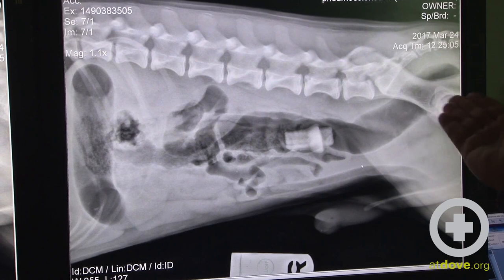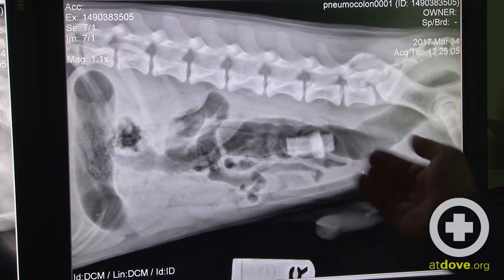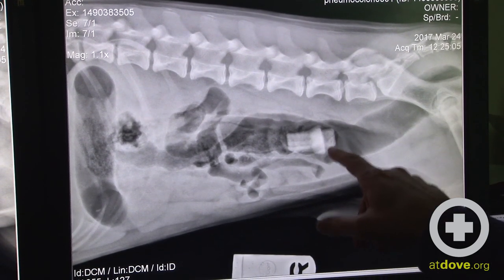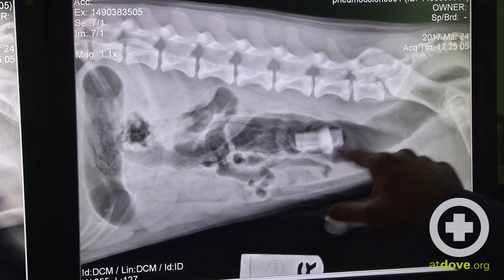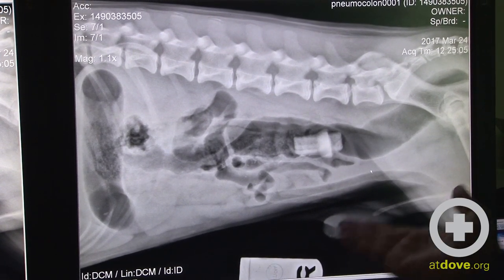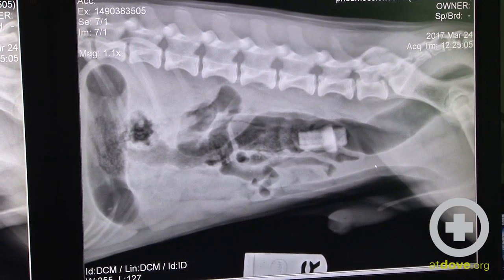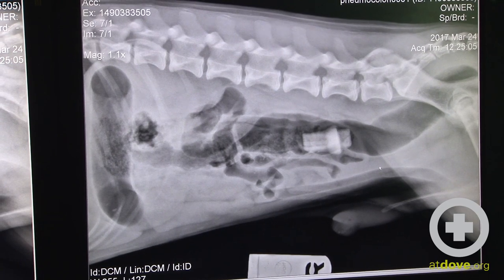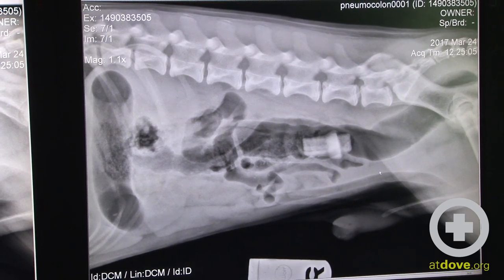On this initial view, we can see this foreign object superimposed upon the colon very well. This initial view certainly makes us think that this foreign body is within the colon.